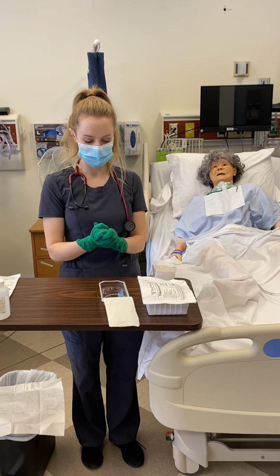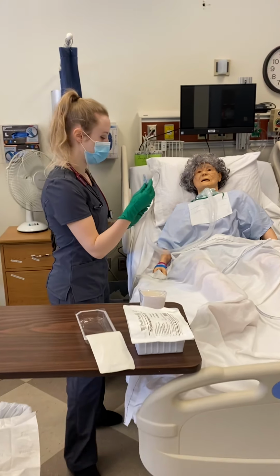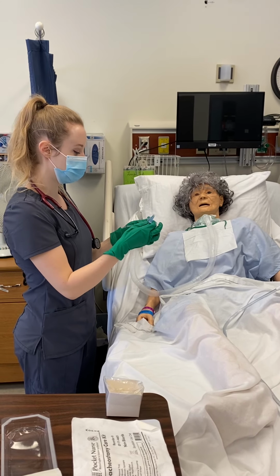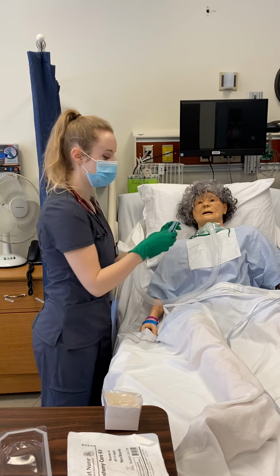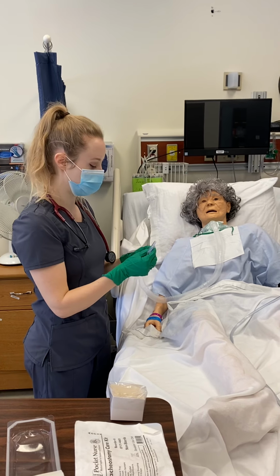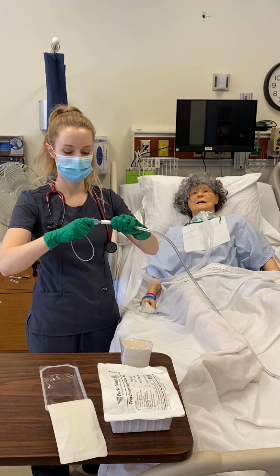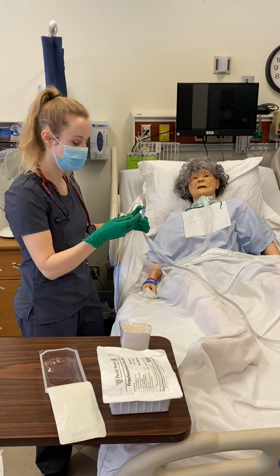Next thing that I will do is take my catheter, and first I will demonstrate nasopharyngeal suctioning. And so I will measure from the nose to the ear to the tip of the xiphoid process to know how far down I should be going. Ensuring that my patient has been hyperoxygenated, I will now break sterility on my non-dominant hand and connect the catheter to suctioning and ensure that it's working okay.